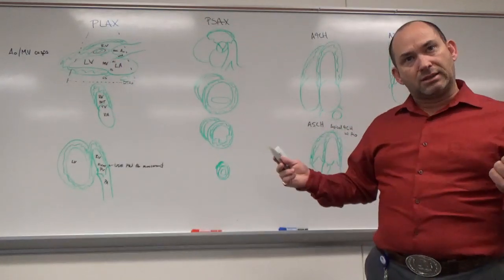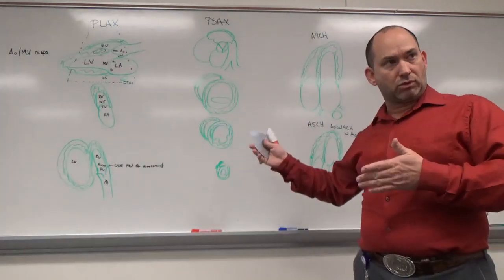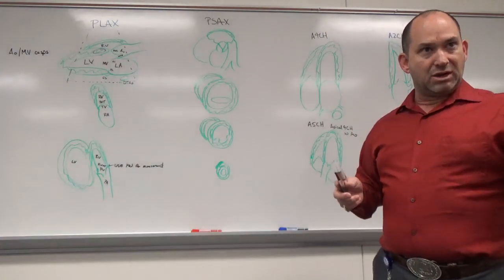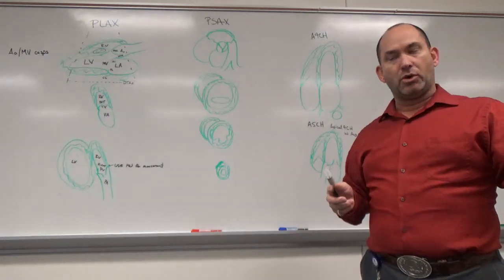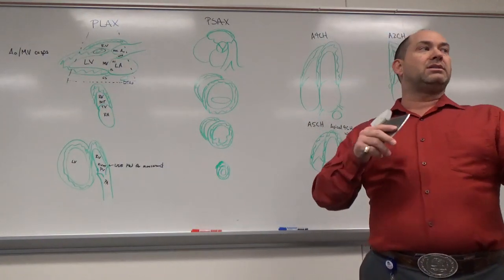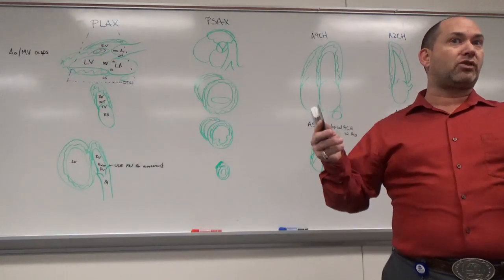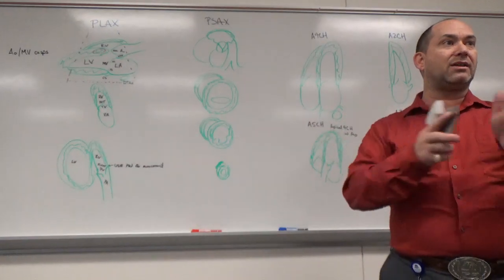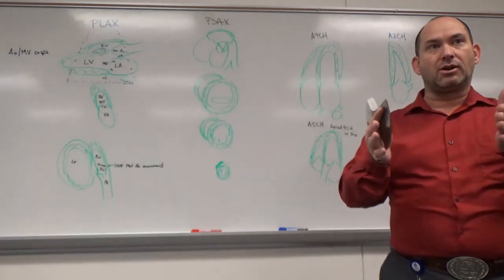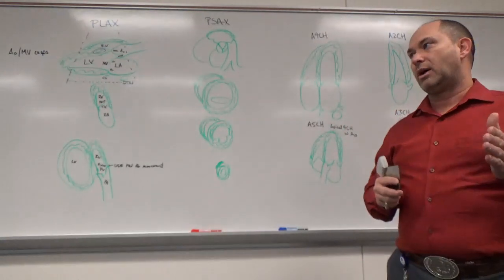Okay? It's like the EKG. We get the electrical signal that tells the heart to squeeze. Does it squeeze immediately on the R wave? No, there's a time delay. So when I tell my patient to stop breathing, it takes about 2 seconds for them to actually hold their breath. What happened in those 2 seconds? They've been breathing and the heart's been moving. So you have to anticipate.